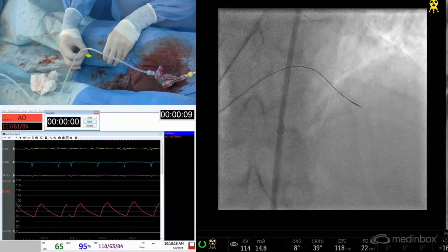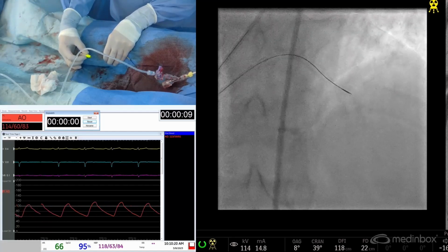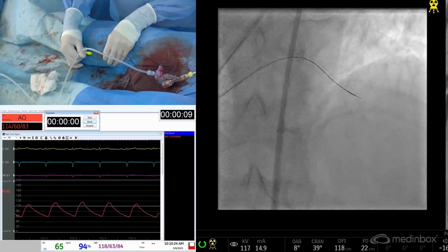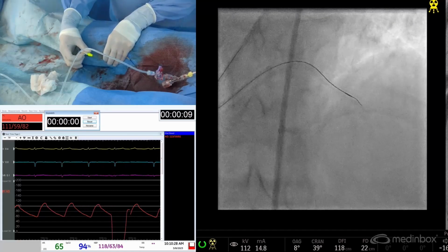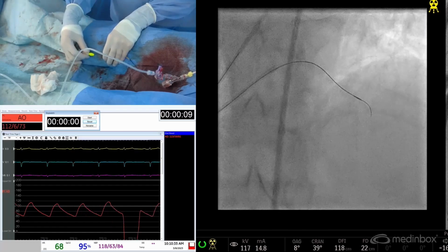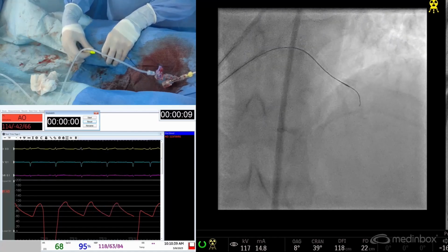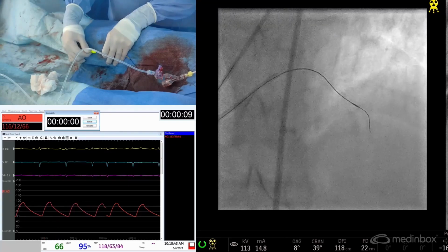And as you all know, imaging was already heralded as something of a game changer initially, but without necessarily the randomized data. Yesterday, when it was published and presented at the ACC, a bit over 1,000 patients were in the intracoronary imaging arm versus 560-ish patients in the angiogram-guided PCI.